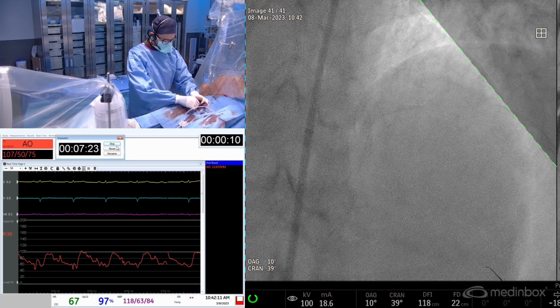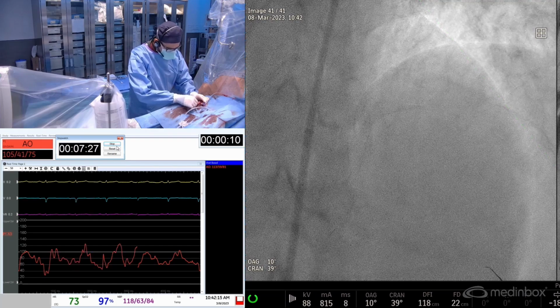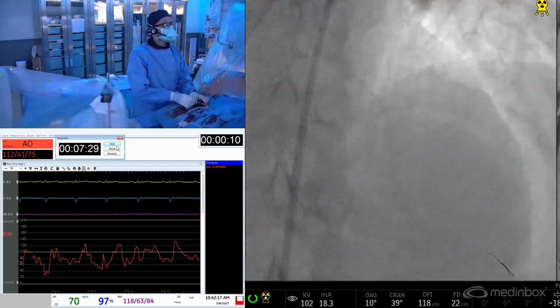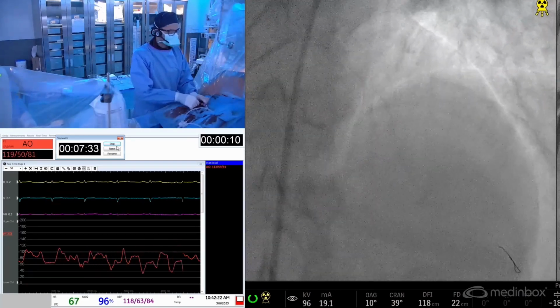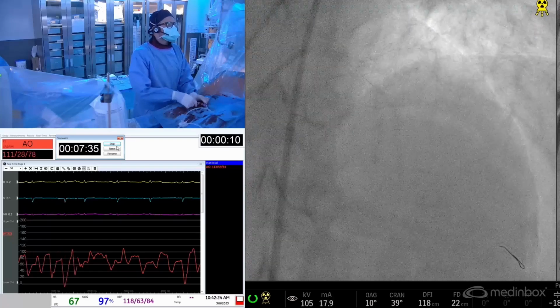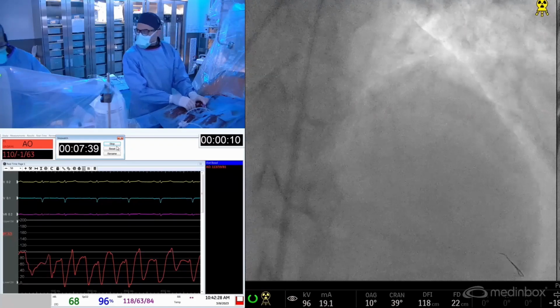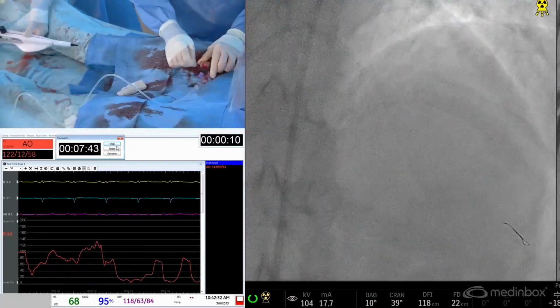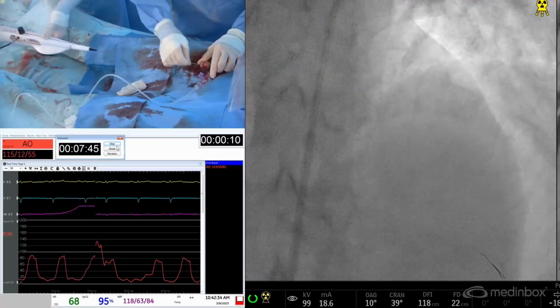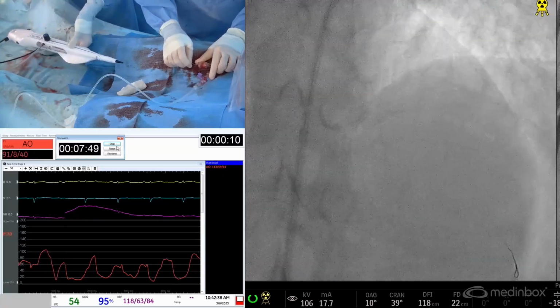And having macerated the lesion in the diagonal, chances are that we'll be able to get expansion as well. Because as the OCT studies in the Disrupt study showed, the name of the game is to get fracture of the calcium plates in the media to get your expansion.